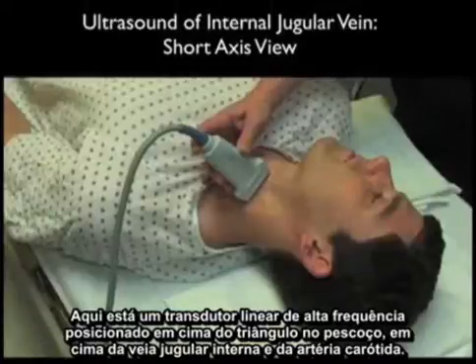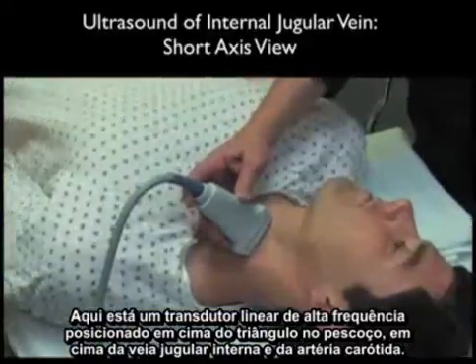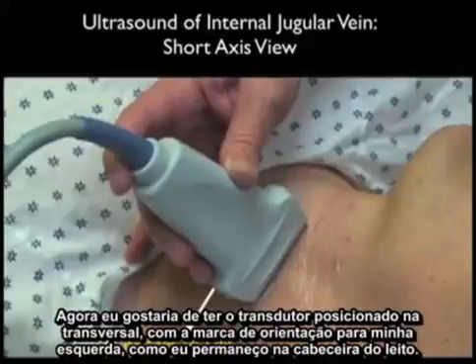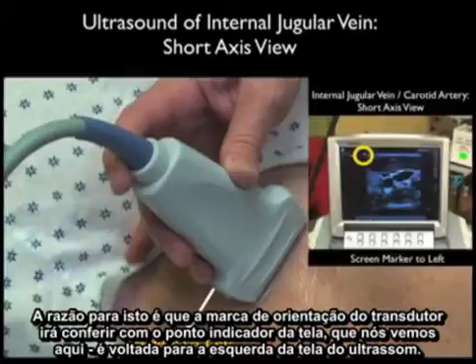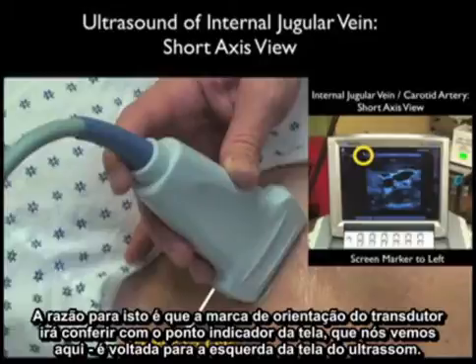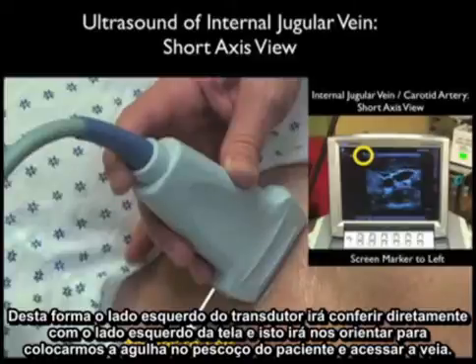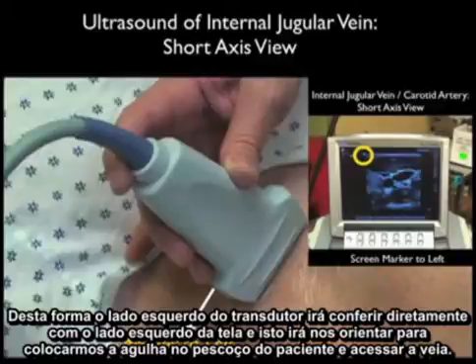Here's the high-frequency linear array probe placed over the middle triangle of the neck over the internal jugular vein and carotid artery. I like to have the probe positioned in a side-to-side orientation with the marker dot oriented towards my left as I stand at the head of the bed. The reason is that the orientation of the probe marker will line up with the screen indicator dot, which is oriented towards the left on the ultrasound screen. Thus, the left side of the probe will orient directly to the left side of the screen, allowing us to orient ourselves as we place the needle and cannulate the vein.